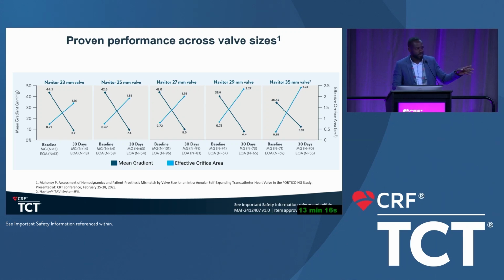So Didier, one thing. Let me challenge you once again, because I like this type of discussion because it's about experience sharing. But we have to integrate as well the technology that we are using. We have had publications showing that in small annuli, potentially with self-expanding platforms, you get good outcomes, good hemodynamics. And you told us, Vinod, that hemodynamics was part of the decision-making for root enlargement. So let me challenge you.